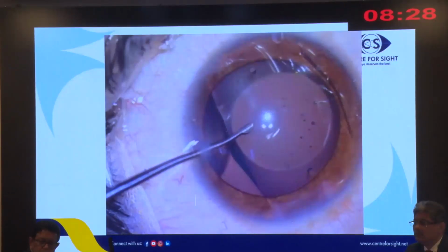But one important thing is proper orientation. Like Tityal showed earlier, IPCL is different, Acryl Phakic is different now, and Oro has also come out. I don't know what their placement is. In some you have to put it upside down, I think in Acryl Phakic. So you need to know beforehand, do a dry run, what is the right side up and how you have to do it.